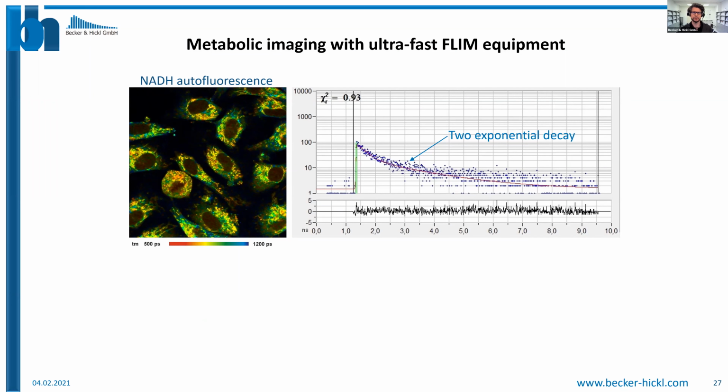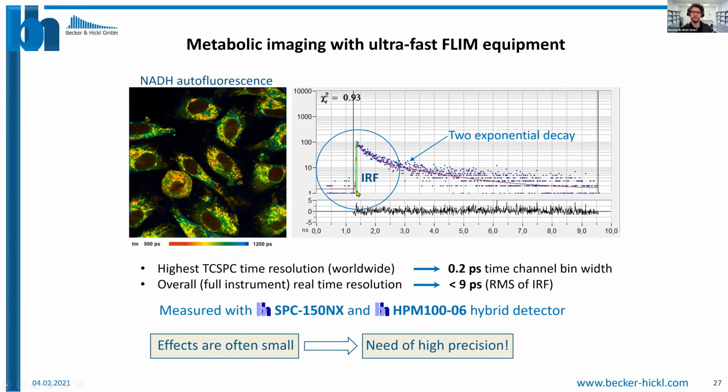Last but not least, I want to show you this. We have been quite surprised that if we measure with our fastest equipment, and you have a really, really narrow IRF in combination with a very high time resolution, even though the sensitivity of the detector is lower, the precision is so much higher that in the same amount of time, you get better results.